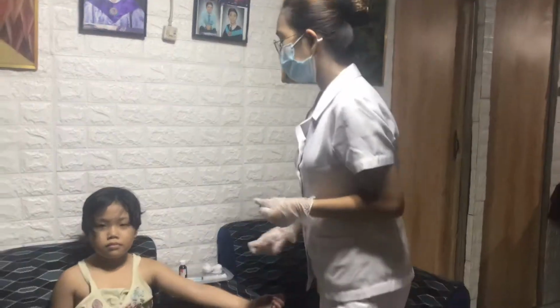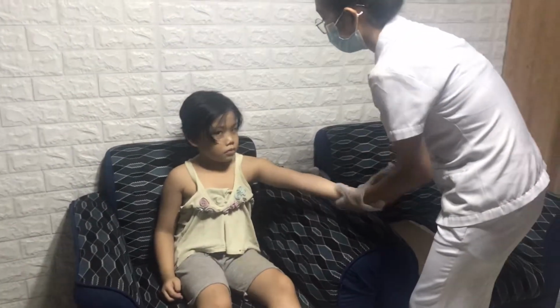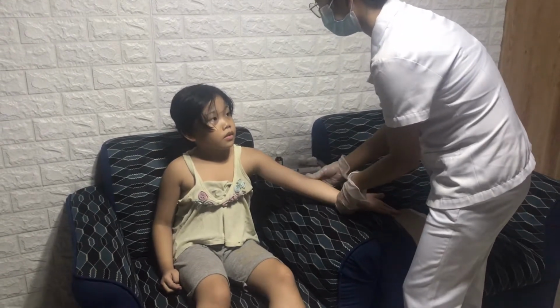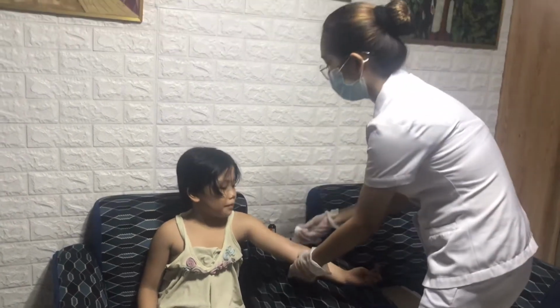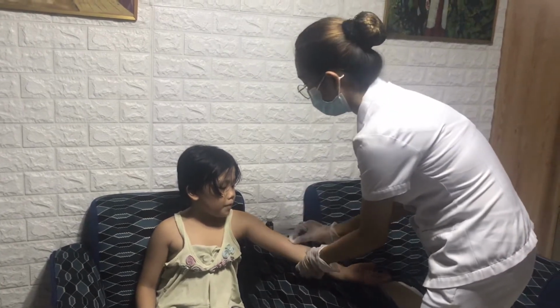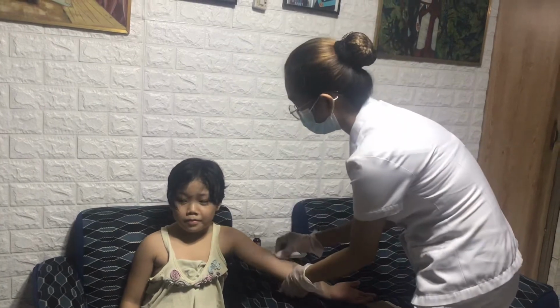All right ma'am, after you position your arm, I will be cleaning this with an antiseptic swab, okay? You apply the antiseptic swab in a circular motion, from the inner part outward.